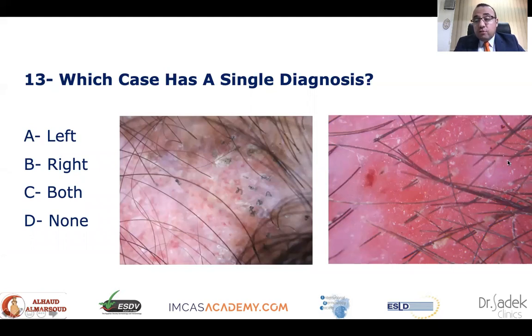The one on the right is actually suffering from lice as well. Here we see the nits, from diffuse inflammation of the scalp, which was secondary to bacterial and fungal infection as well. The one on the left was suffering from DLE of the scalp.